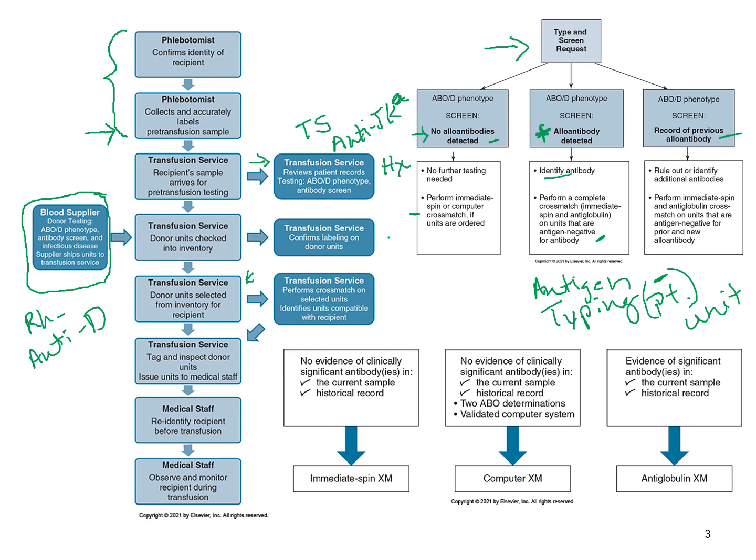And of course, you're going to do the same thing you would if you had an antibody here, where you're going to honor that antibody, you're going to give antigen negative, and you're going to do that full cross match on that patient. All right, so back down over here.